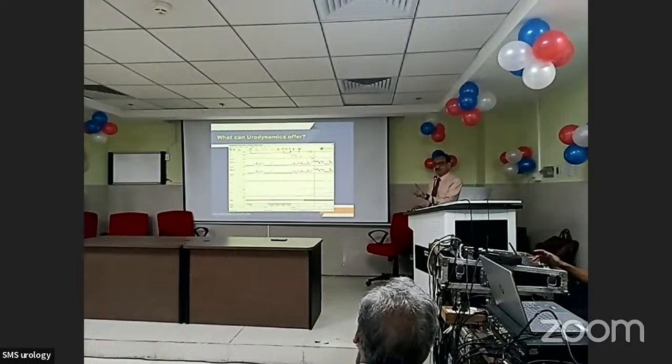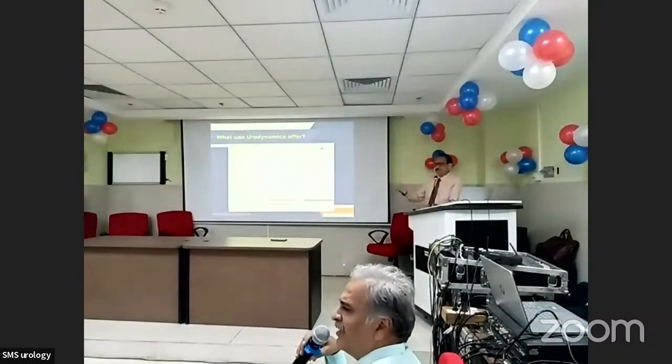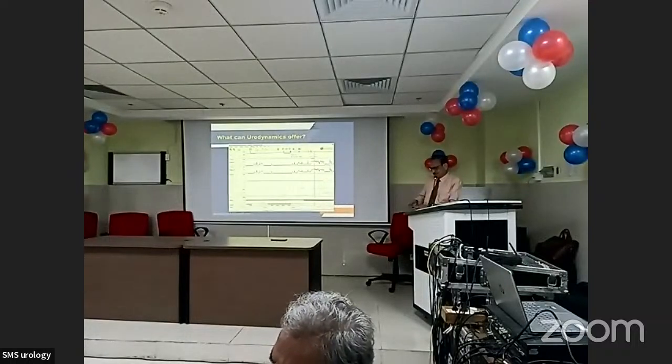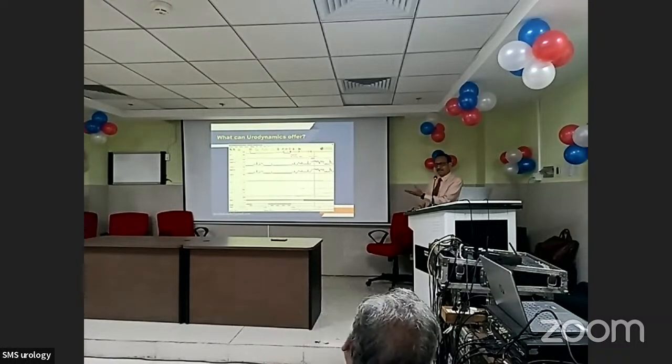But it's a correct recording. So no question about that. The recording is perfect. That's the scientific advice. But EMG records because she's straining to void. So even if she coughs, she will show high EMG recording levels. The problem is that the pelvic floor also contracts with the strain, which EMG picks up the most.